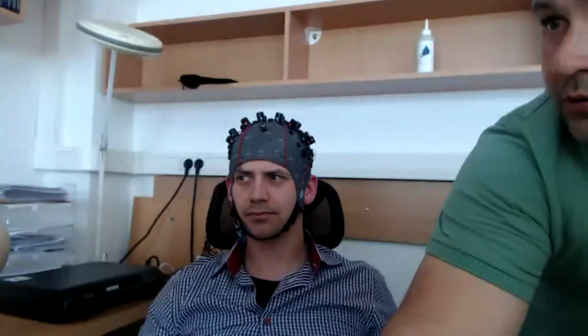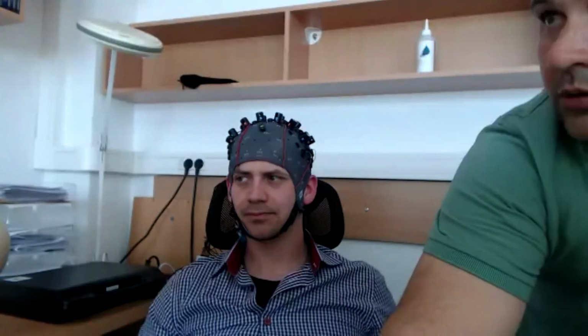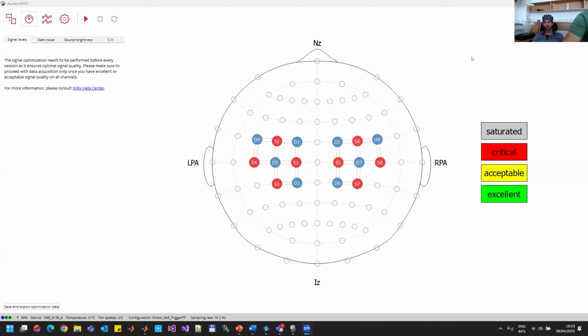Screen sharing has stopped. Okay. Let me start sharing it again. Sure. Okay. And let me move this bar from here. Okay. So this is the montage that Alex has on his head. With red, we have the sources. With blue, we have the detectors.